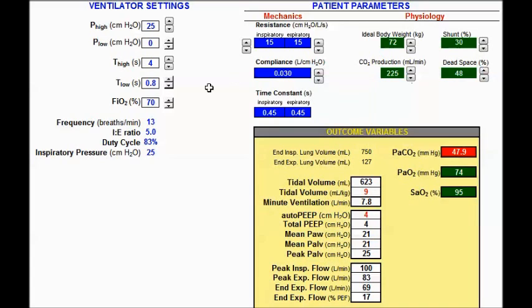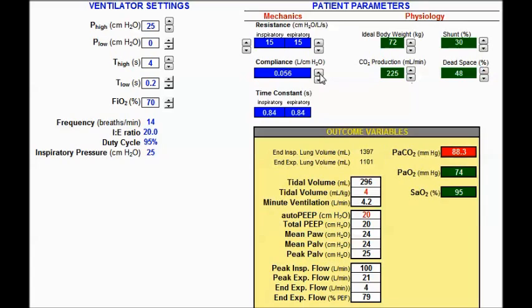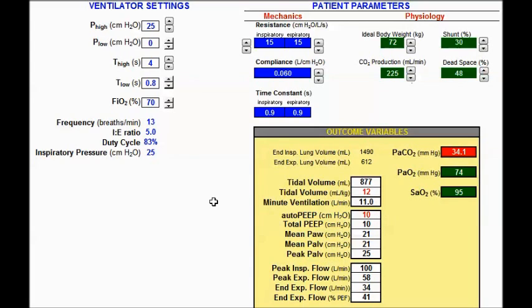Going back down to t-low of 0.2 and changing compliance to 60 — the patient has pretty much normal lungs and we should really be taking them off APRV. At t-low 0.2: tidal volume is in the safe range but there is quite a bit of auto-PEEP. At the other extreme, t-low of 0.8: tidal volume is unsafe and auto-PEEP is also unsafe. Those are the results for the first method.